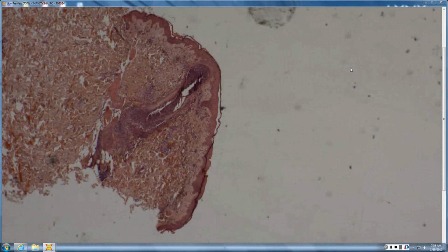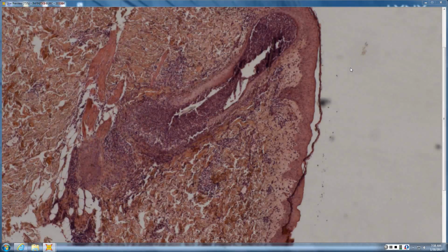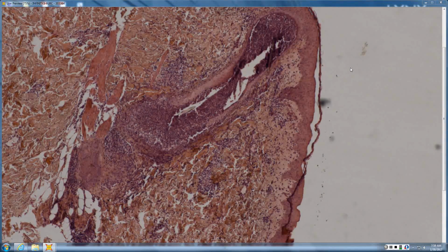So that kind of looks like a follicle. Looks like a follicle, and what's in the follicle? Pus. So pus in a follicle. I mean, that's suppurative folliculitis. So suppurative folliculitis, which can be caused by? Lots of things. Infectious, so fungus, bacteria. It can be a drug. Yeah. So pustular drug, acne, bacteria, fungi.